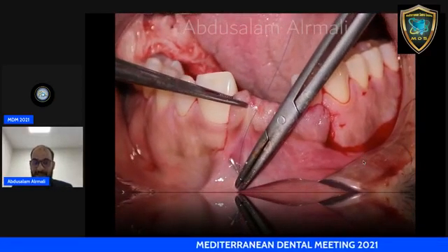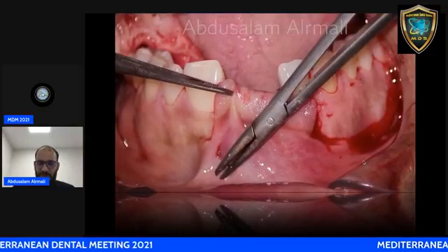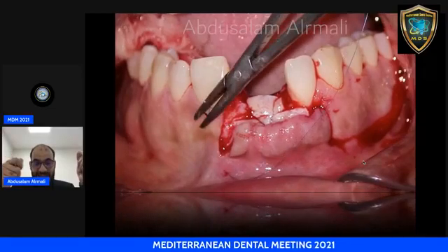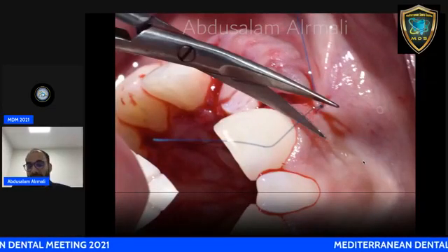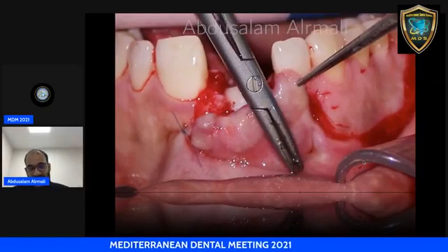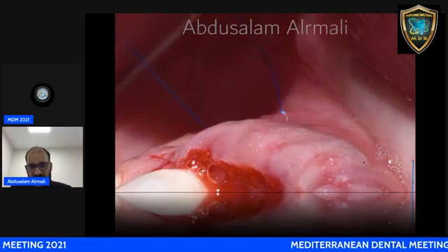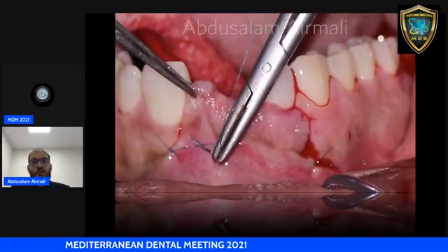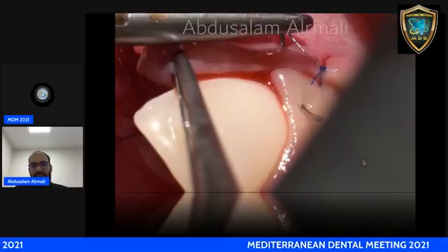Move it passively. Start to suture the vertical by taking periosteal sutures at the end of the flap from inferior for both sides. Try to hold your flap coronally. At the end of suturing, you will see that your flap is moved coronally without any tension, passively, to suture it in a coronal, crestal direction. So start with the vertical releasing incision, with 6-0 Prolene suture or 6-0 vicryl suture, no difference. Try to do two periosteal sutures at the bottom of the two verticals, complete the vertical suturing on both sides, and keep the crestal suture for the end.